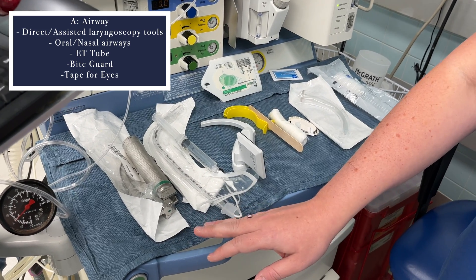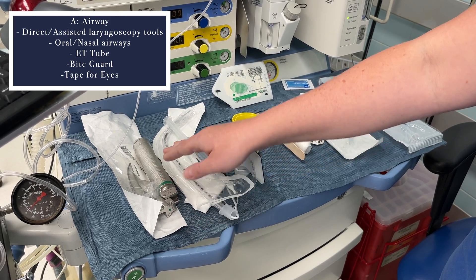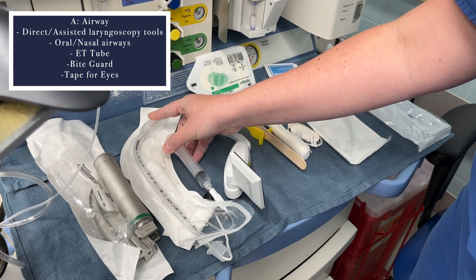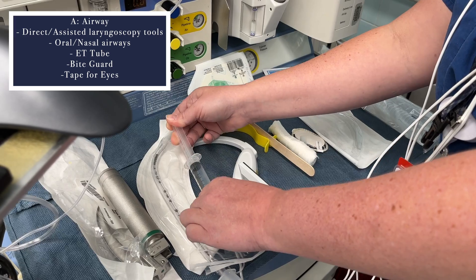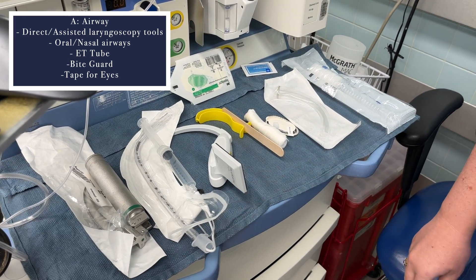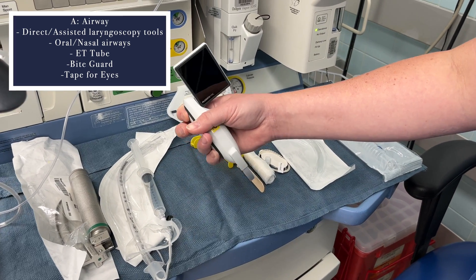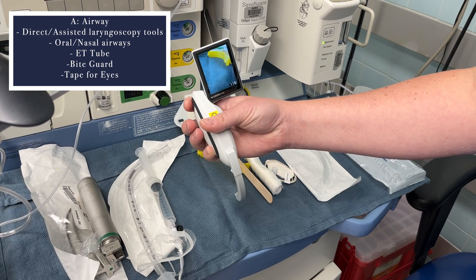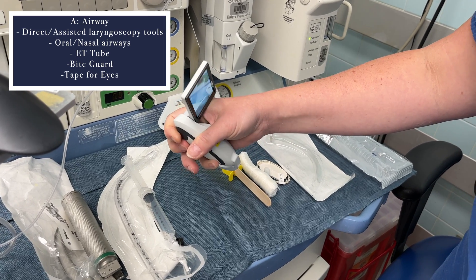The next letter is A for airway, and that's a pretty big and important setup. You start with your laryngoscope and choose the blade size for your patient. You'll have an ET tube with stylet and a syringe to inflate the balloon — always make sure the balloon doesn't have a leak and leave the syringe handy. It's also nice to have a standby video laryngoscope; this is a McGrath, which can assist with intubation if you're having difficulty, so check that it's charged and ready to go.